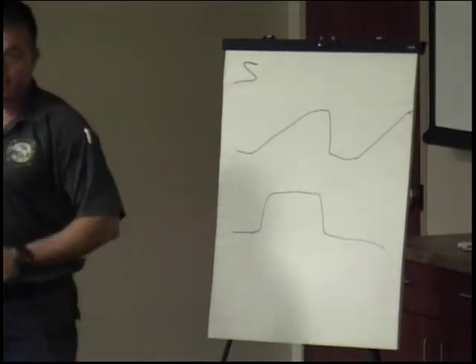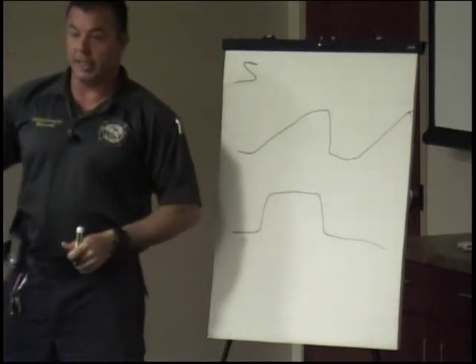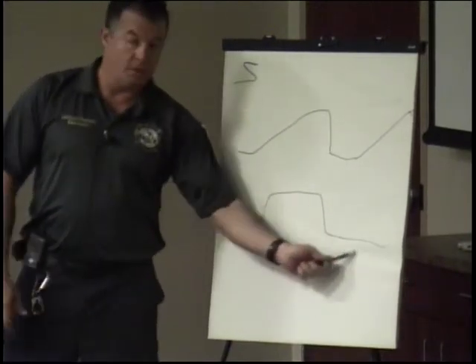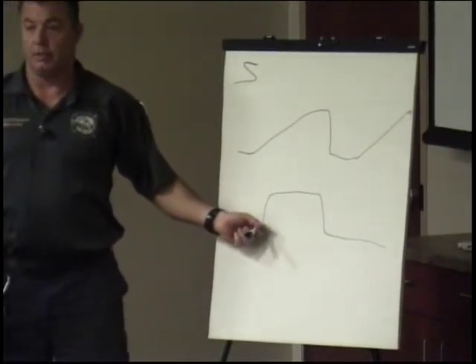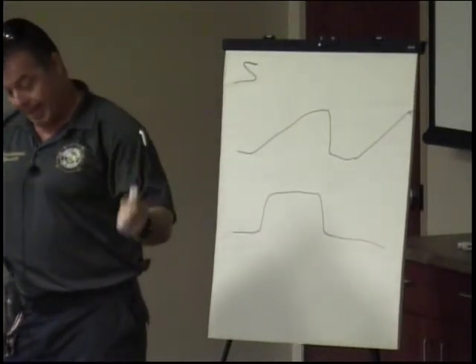The CHF patient, the early CHF patient that has wheezes, and you might not be sure if it's COPD or CHF, if they have the wheezes and the history and the meds to go with it, but they have a normal waveform with the wheezes, then they're probably a CHF patient and not a COPD patient. So that's something to take into account.